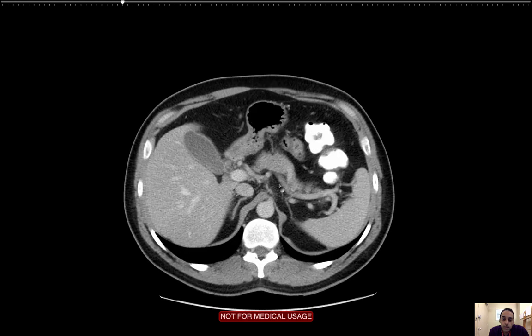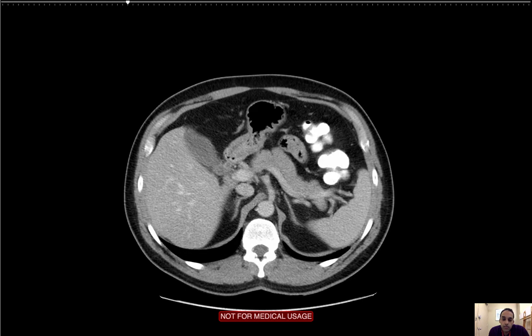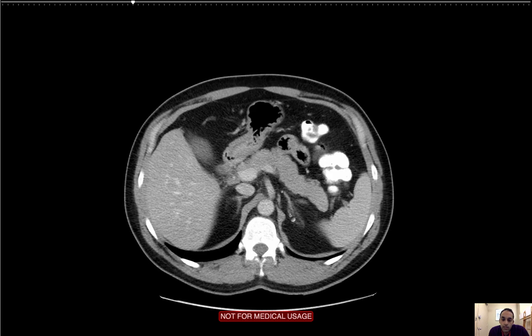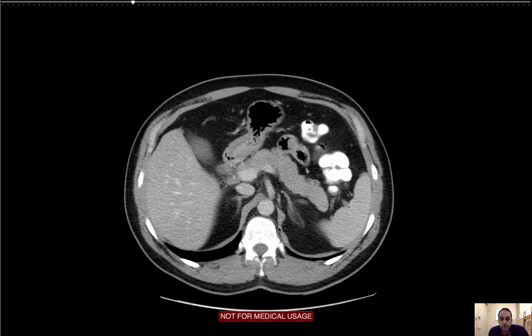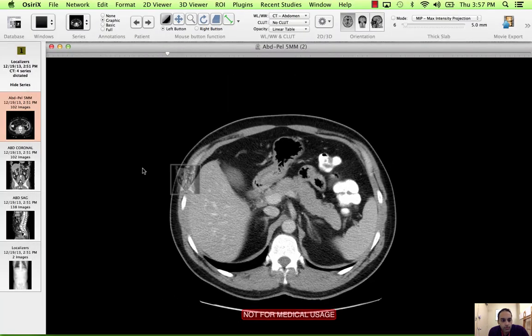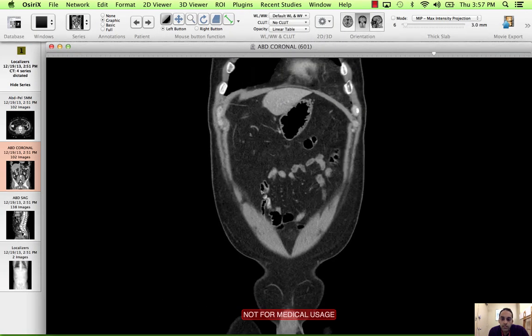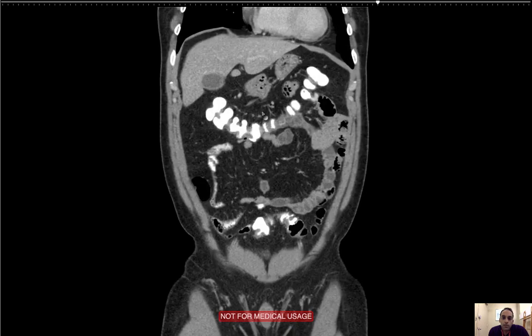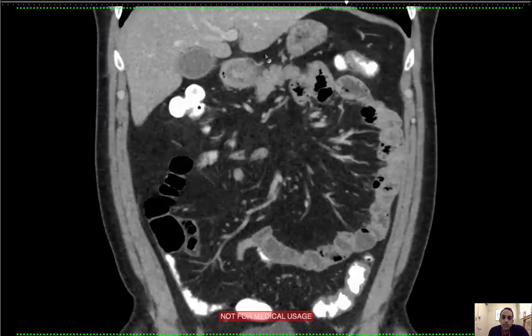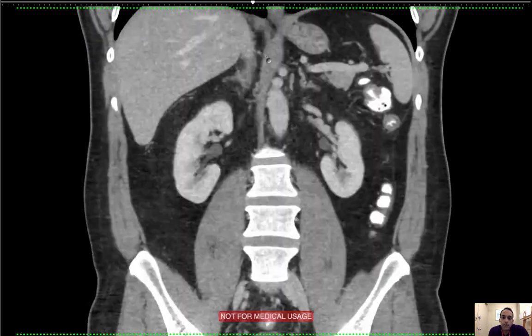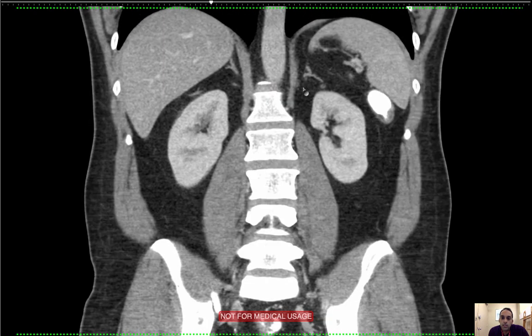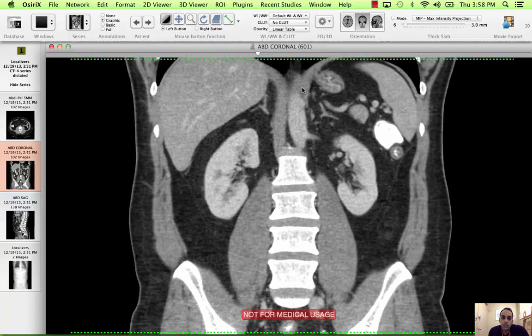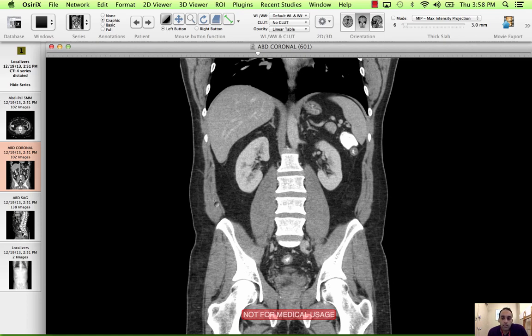I'm going to continue to the adrenals. Here's the right adrenal and here's the left adrenal. I'm looking for any adrenal nodules. I can do that nicely on the coronal plane. I can see them pretty nicely here — they're basically a Y-shaped organ. There are no adrenal nodules. The adrenals are unremarkable bilaterally.